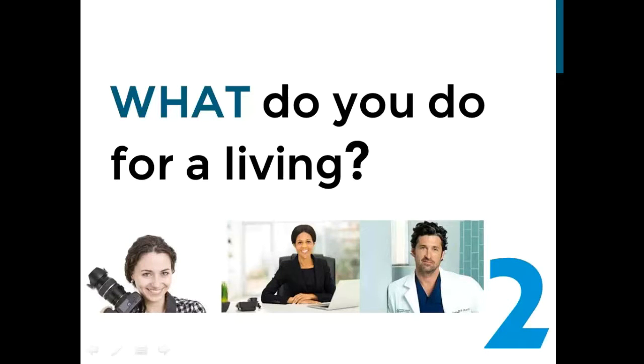Do you take into account, like you said, a mechanic or a plumber, the lighting conditions where they work? Absolutely, and a lot of times they're having to use a flashlight or something to help them anyway. And I think just the fact that you've given them that flexibility of focus change without having to lift their glasses up, adding that little extra light is not an issue for them.